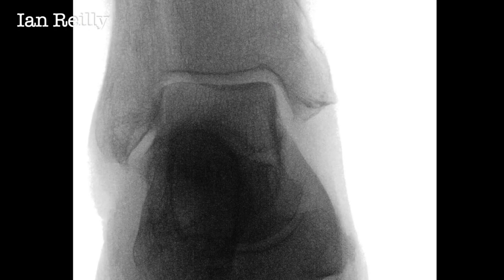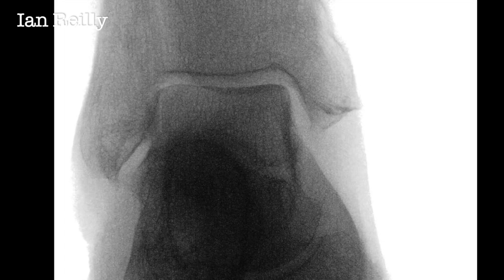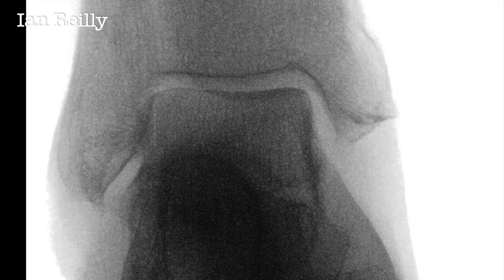The first thing to do is to take a test x-ray just to check that I've got the x-ray beam nicely outlining the talus and the medial malleolus of the ankle.